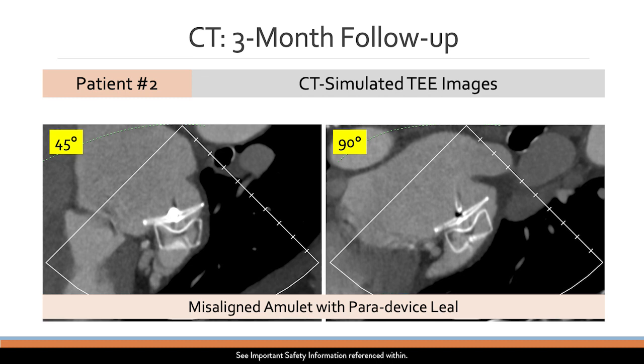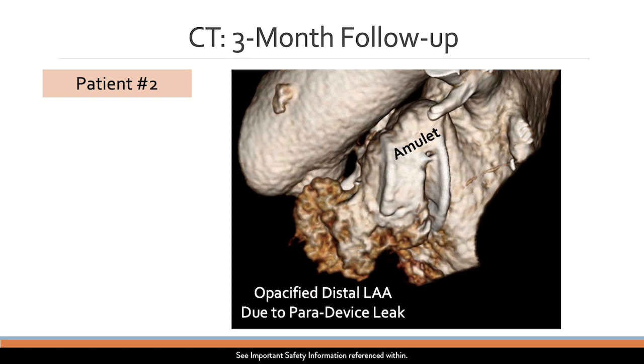Yes, of course. It's a malpositioned, malaligned device. And when you do this, because there is flow into the appendage, now you can see the distal appendage. So it's an easy way to do it. The opacified distal appendage.